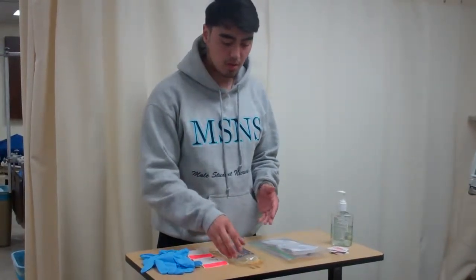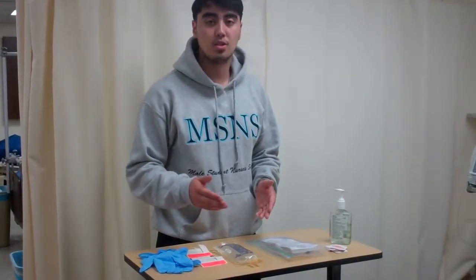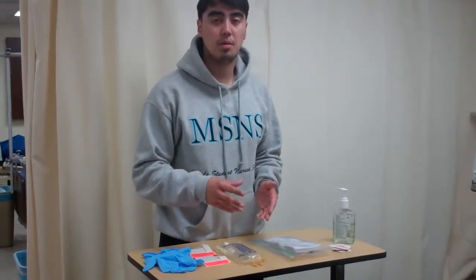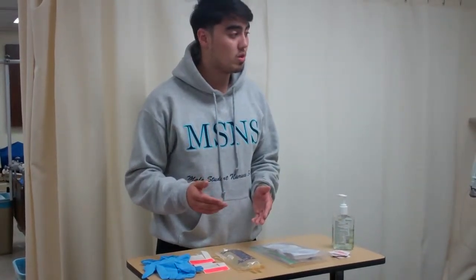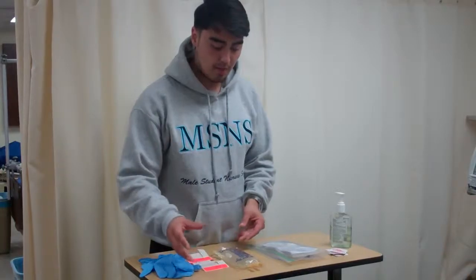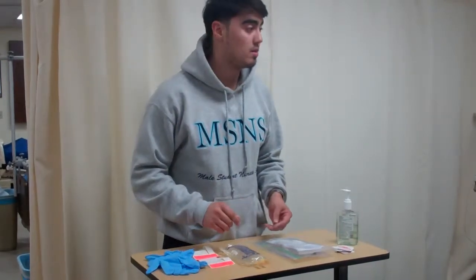So the first check that we want to do is check the dilution of the medication. We want to ensure that there's enough volume to dilute the medication so that it doesn't exceed the final max concentration. The next thing you want to do is know the amount of volume that you're going to be administering, plus you have to also add the flush that you'll be administering. And then lastly, determine the rate that the physician wants you to give to the patient, okay? So now that we have that, usually it'll have a sticker that says all that information. If not, you go ahead and make it yourself, and then we'll stick it on to the medication.